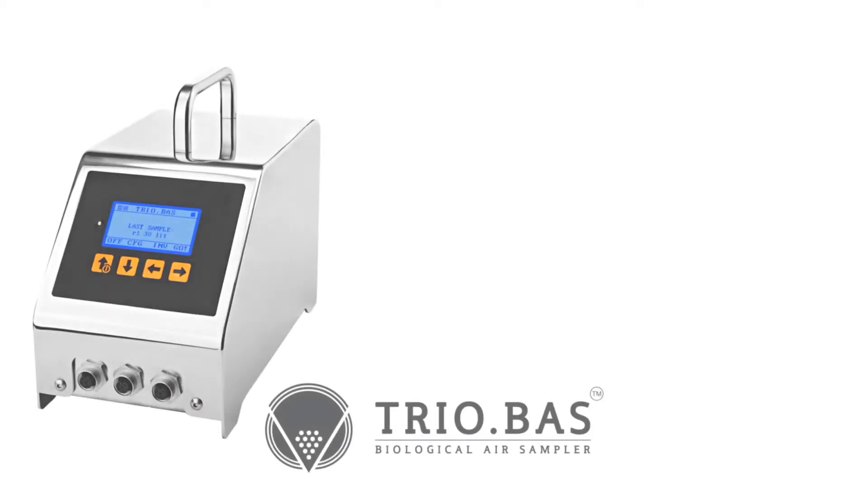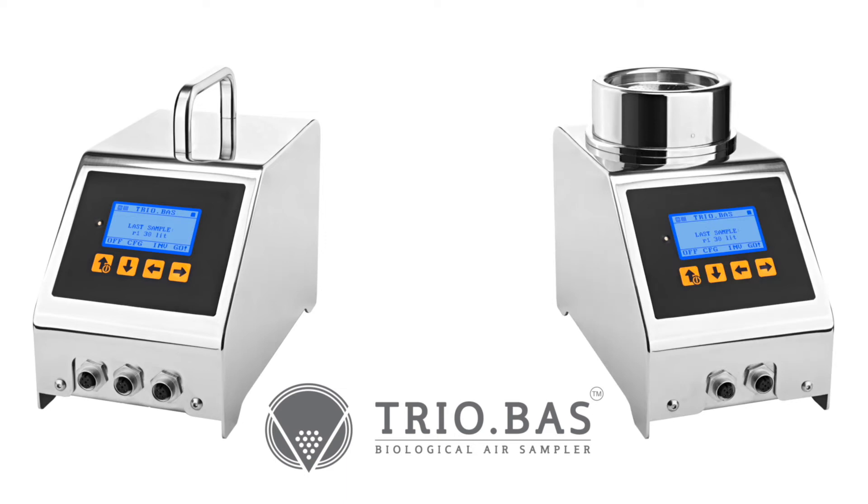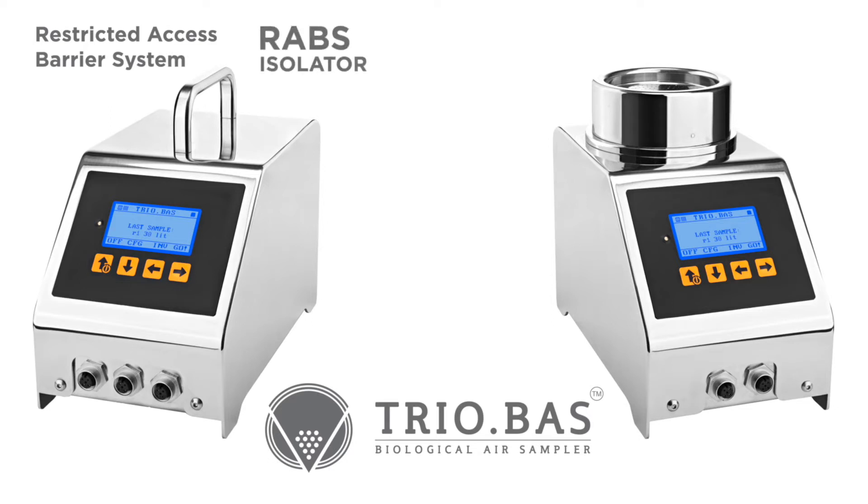Featured are two uniquely designed instruments from the Triobos microbial air sampling family: the Restricted Access Barrier System, or RABS, isolator format, and the Multiflex.